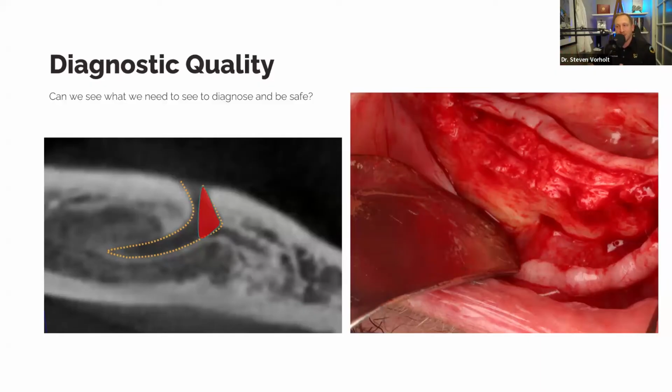But this area that's been shaded in red is what's considered the anterior loop. This is the portion that if you were to look at the mental nerve directly, like you're seeing here on the right, when we do a full thickness flap on the mandible, we're looking directly at the mental foramen. What is beyond that or more anterior mesial to that is this red shaded area. Important to know how much that is. And you can see that on a CT previous to doing any surgery.